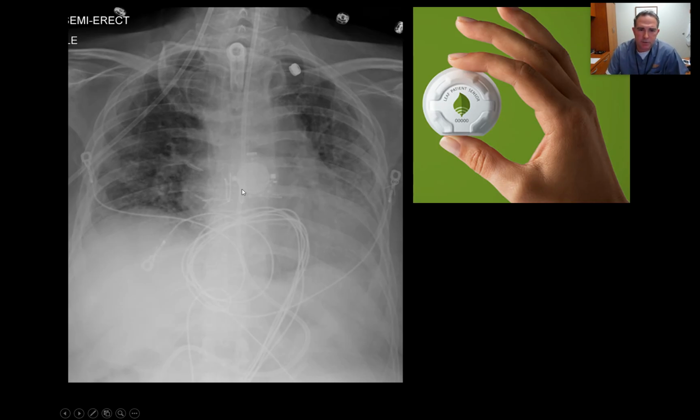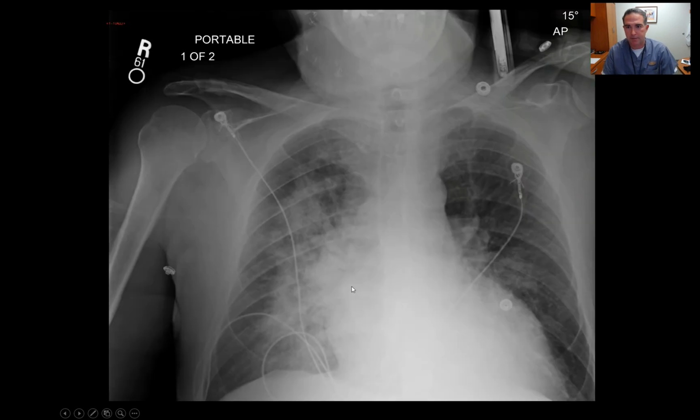About a year ago, they started putting these on patients. These are little patient monitor things where they would be able to know where the patients were and if they're getting up out of bed and those types of things. We trialed it maybe for about 6 months, and then all of a sudden it disappeared. So I'm guessing we're not doing it anymore, but just good to know if that comes back around.